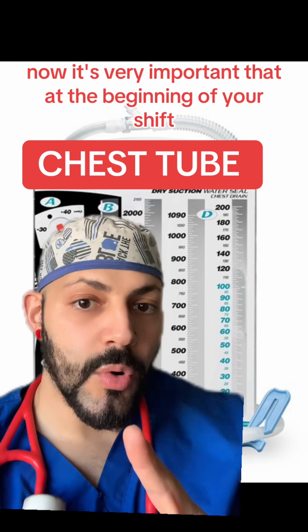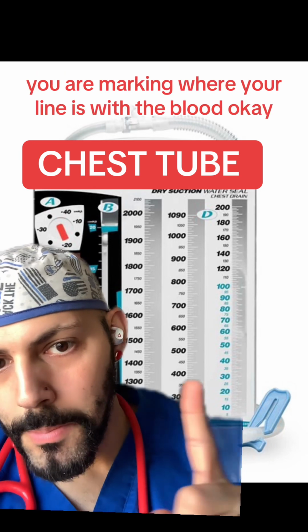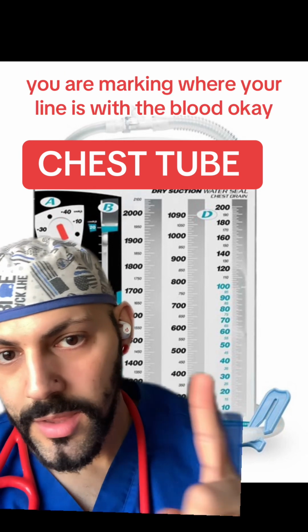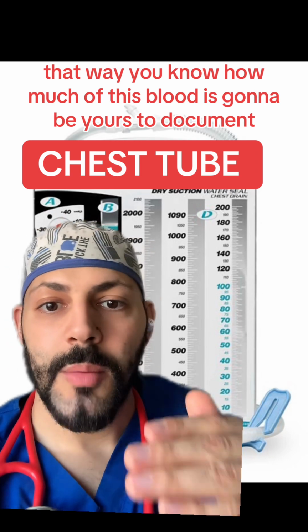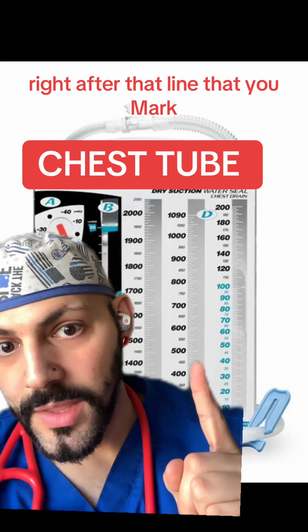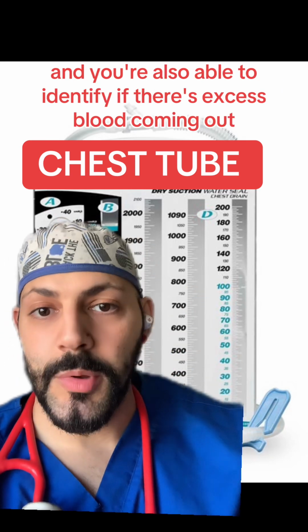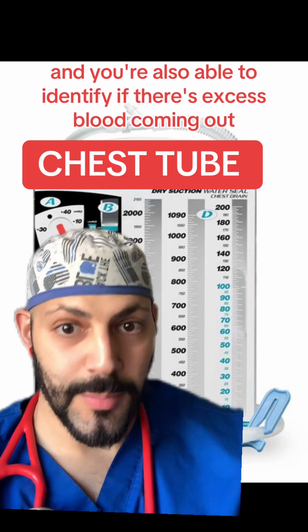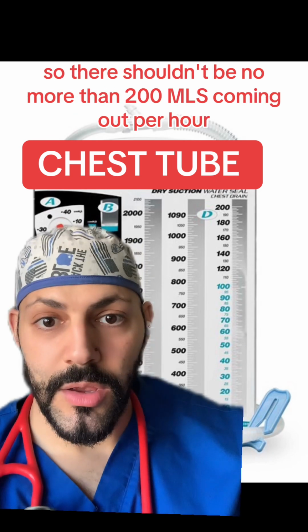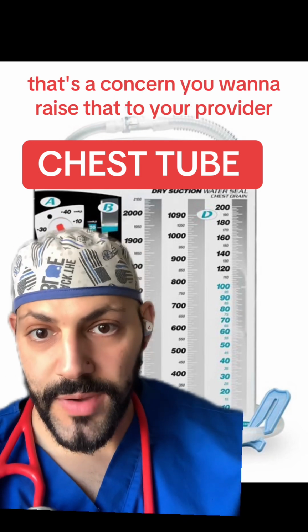Now, it's very important that at the beginning of your shift, you are marking where your line is with the blood, okay? That way you know how much of this blood is going to be yours to document, right? After that line that you marked, that means everything past that line is yours. And you're also able to identify if there's excess blood coming out. So there shouldn't be more than 200 mLs coming out per hour. That's a concern. You want to raise that to your provider.